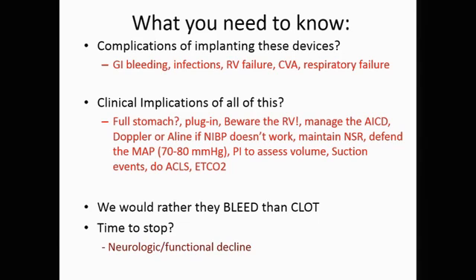Defend the mean arterial pressure. Have a floor of 70 or 80. Use the pulsatility index of the device, if it reports it to you, as a way to assess their volume status. If they have a suction event, give them volume. If they need ACLS, do it.